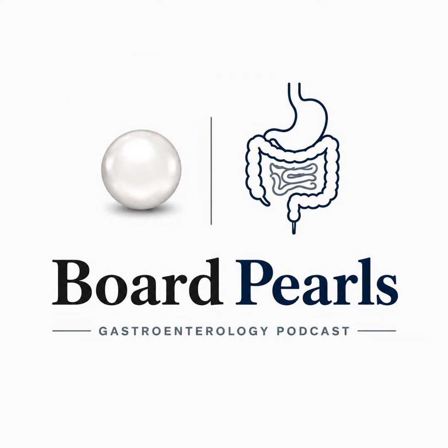bleeding. There is one diagnostic parallel in this territory. Suppose a patient had pancreatitis and is left with a persistent tail cyst, and imaging cannot tell whether it communicates with the duct. The question is whether this is a benign pseudocyst or a mucinous neoplasm, and you answer it with EUS guided aspiration and cyst fluid analysis.